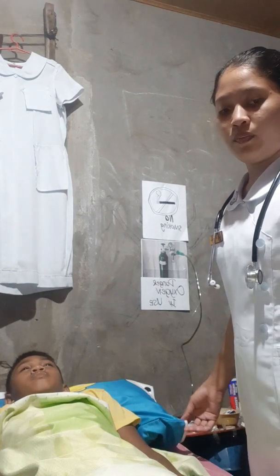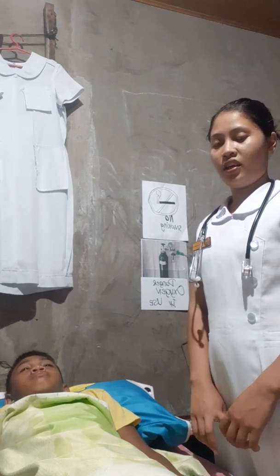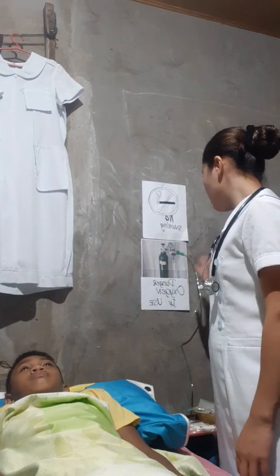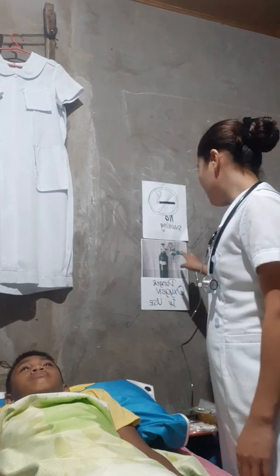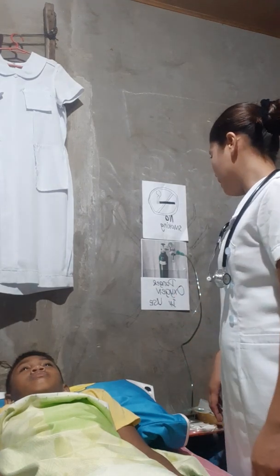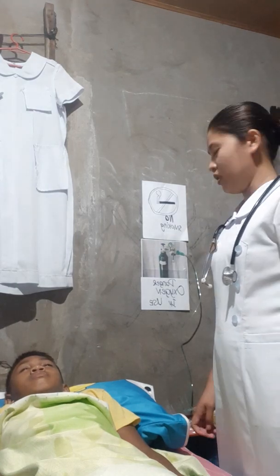So, next for implementation, we need to set up the oxygen equipment and humidifier. So, attach the flow meter at the oxygen tank or in the wall outlet. Then, the flow meter should be in off position. Next, the humidifier should be attached at the base of the flow meter.